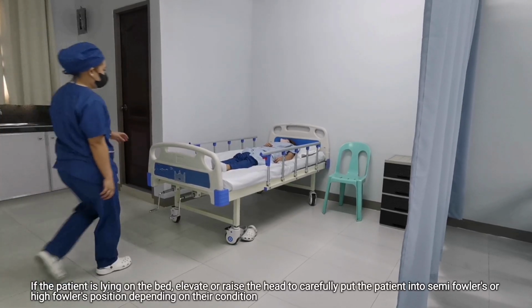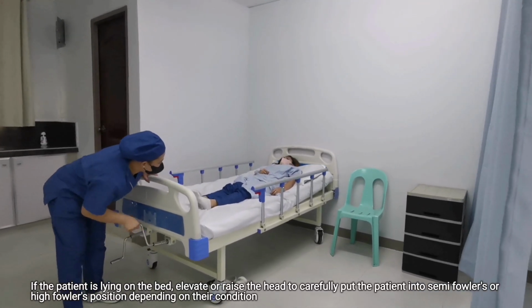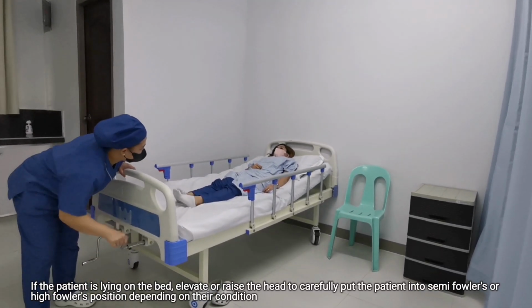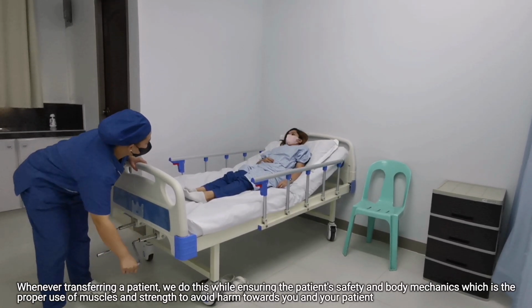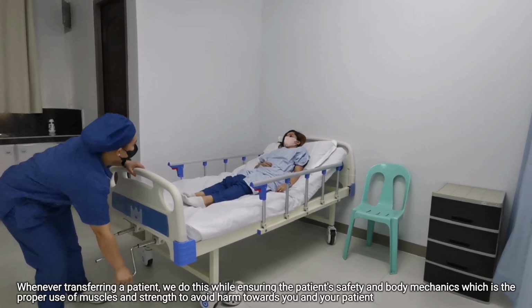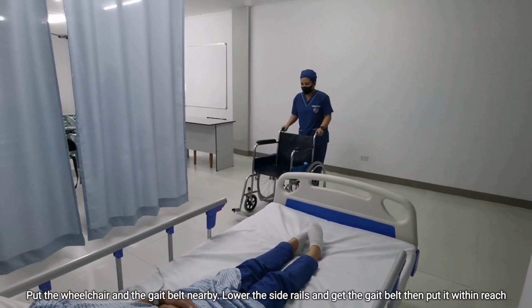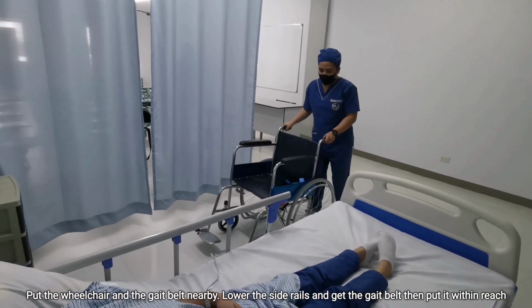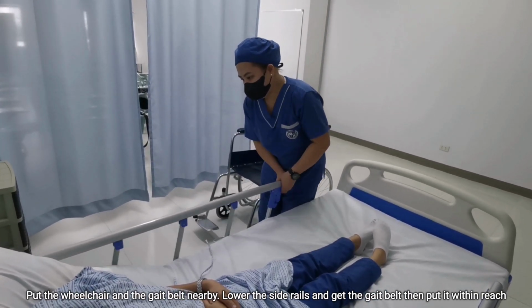If the patient is lying on the bed, elevate or raise the head to carefully put the patient into semi-Fowler's or high Fowler's position depending on their condition. Whenever transferring a patient, we do this while ensuring the patient's safety and body mechanics, which is the proper use of muscles and strength to avoid harm towards you and your patient. Put the wheelchair and the gait belt nearby. Lower the side rails and get the gait belt, then put it within reach.